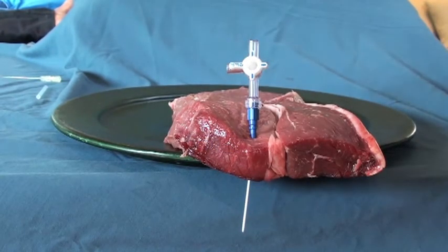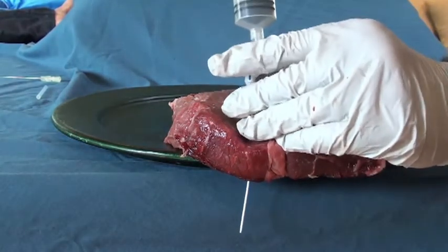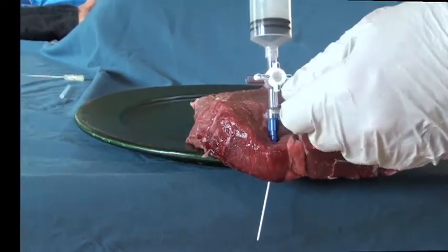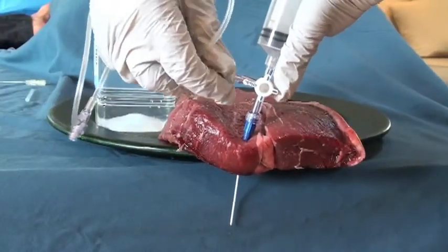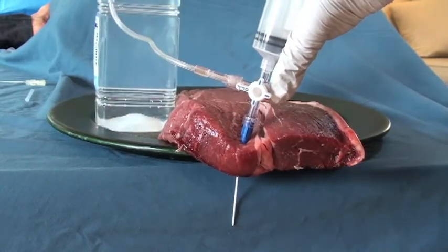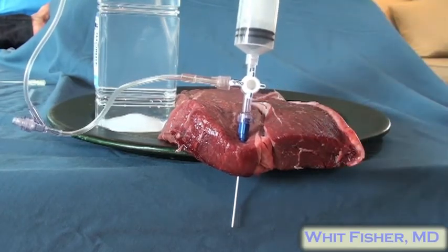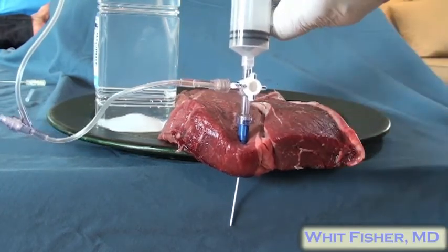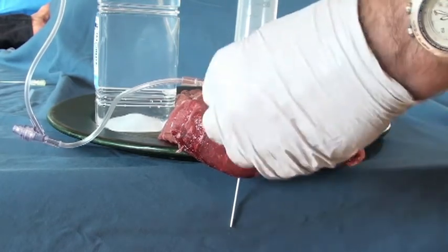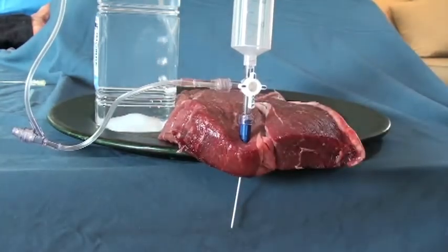Then I took the three-way stopcock — which is also in our cordis kits — attached that and a large syringe on the end of it, and finally put a section of IV tubing, which I cut short, into a bottle of water to create a water seal. Then I simply started re-inflating his lung, at least a little, by pulling air out of the chest cavity with the large syringe and turning the stopcock to push it out to the IV tubing.